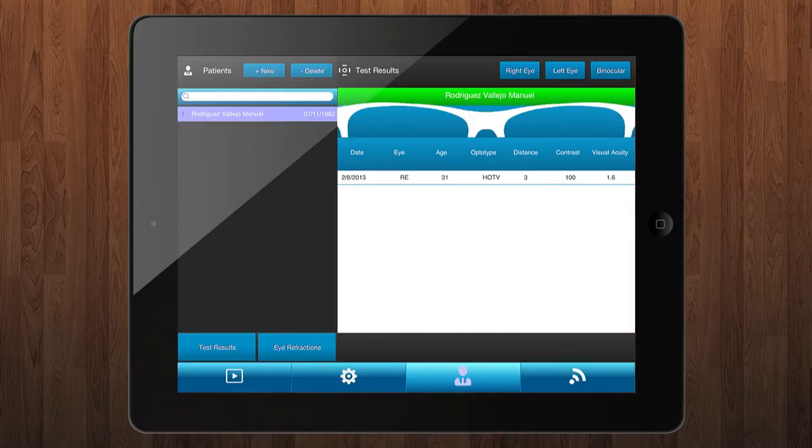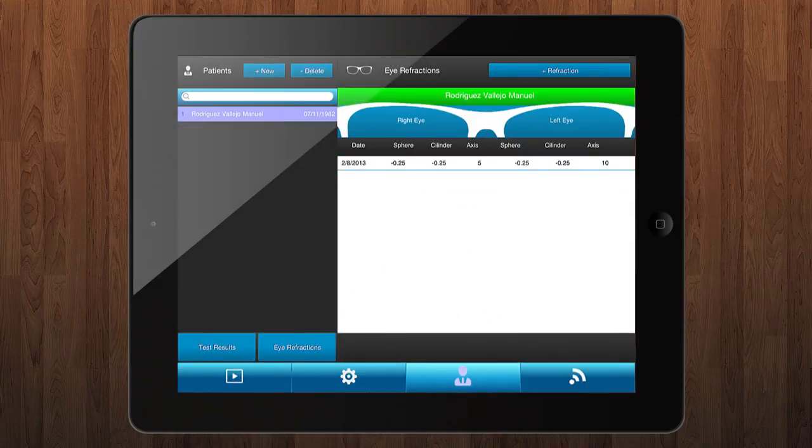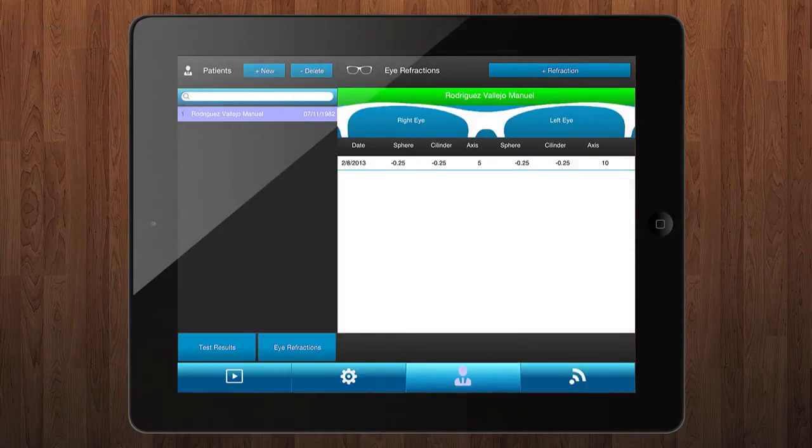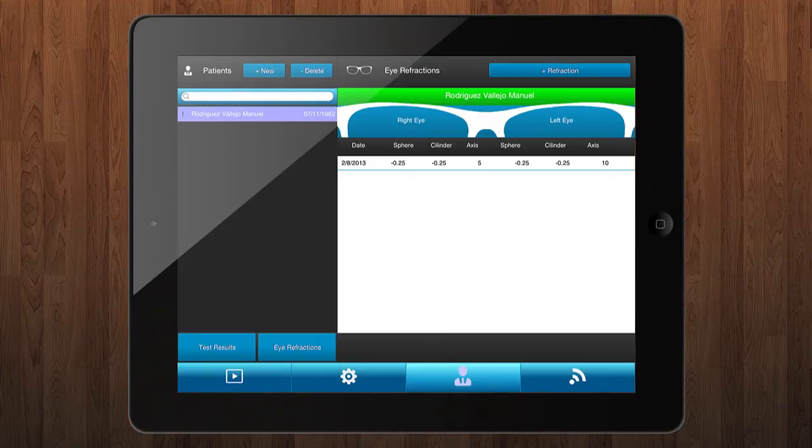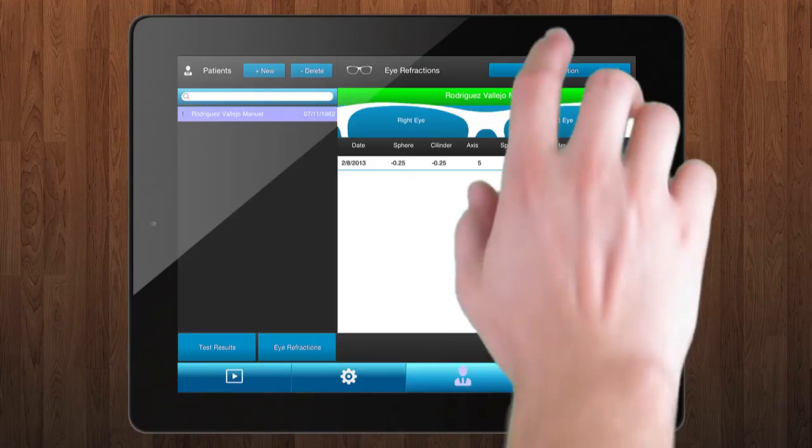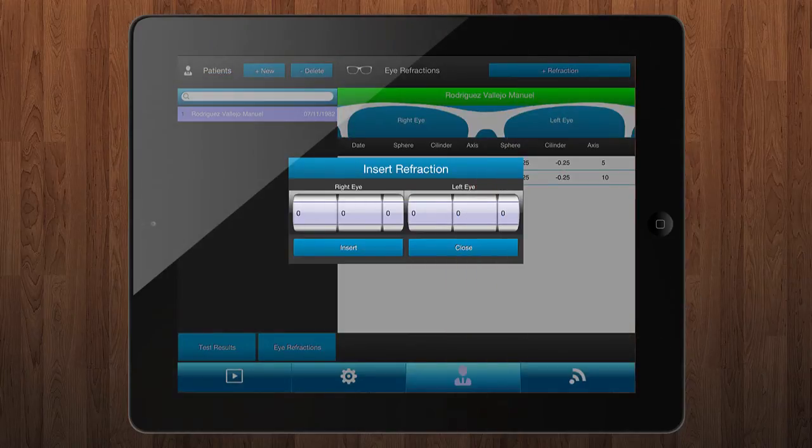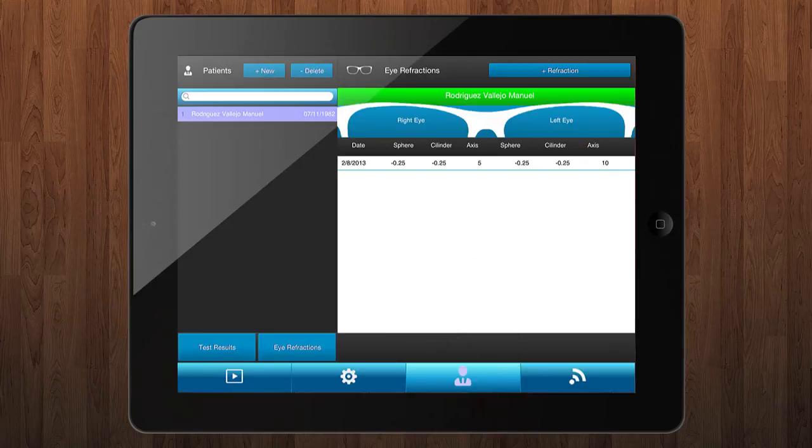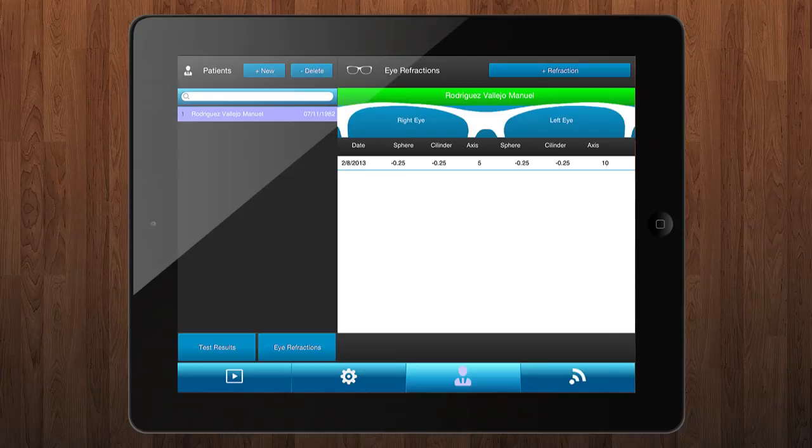Then navigate to the refraction screen. Select a patient and add a new refraction by pressing on new refraction button at the right side. It could be able to save test results with or without compensation. To do this you have to create the patient and the refraction before beginning the test.